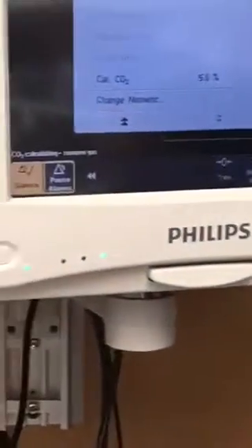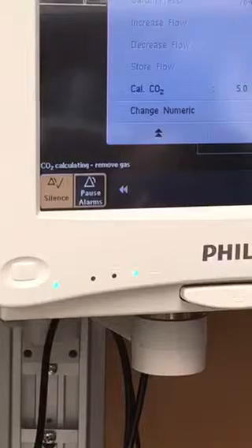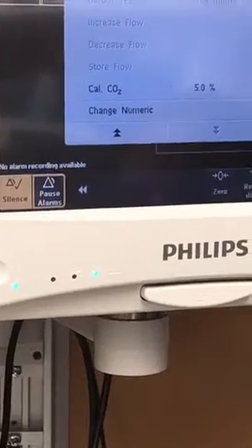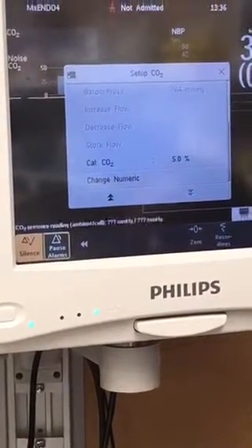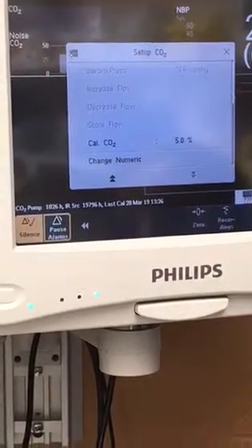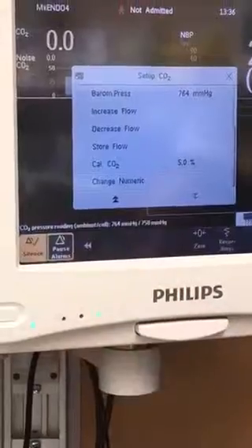All right. Once you hear that, it closed the tank. And it's going to tell you if it passed the calibration or if it failed. Hopefully it passed. Calibration done — so it passed. Congratulations.